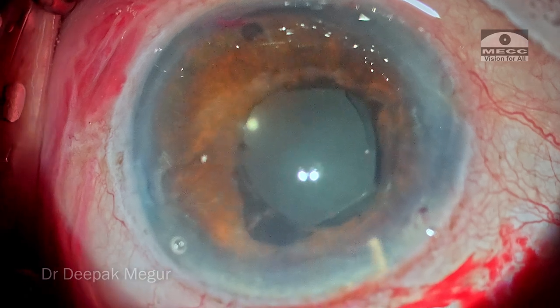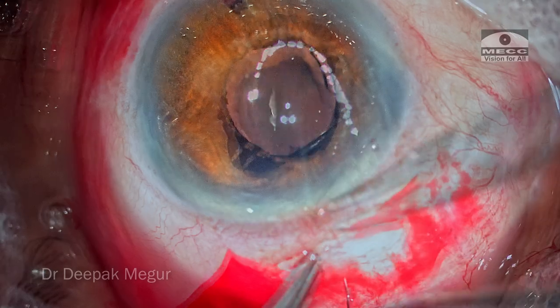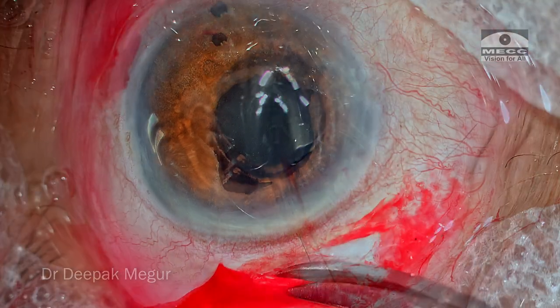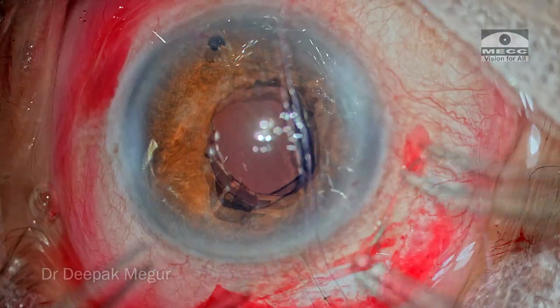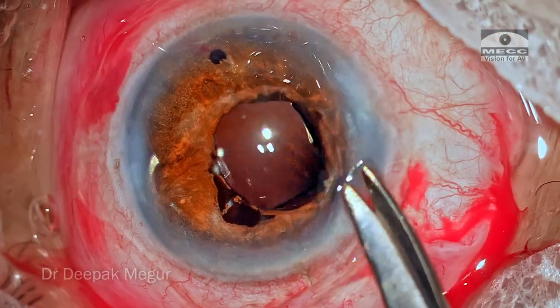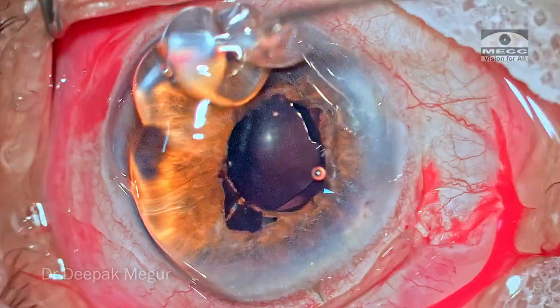Since the patient had a significant amount of pre-existing astigmatism against the rule, I'm going to use a single suture at 12 o'clock to counter this astigmatism. A nylon suture is put and the conjunctiva is closed with Vicryl. Intracameral antibiotics are placed. That's it, the case is done.